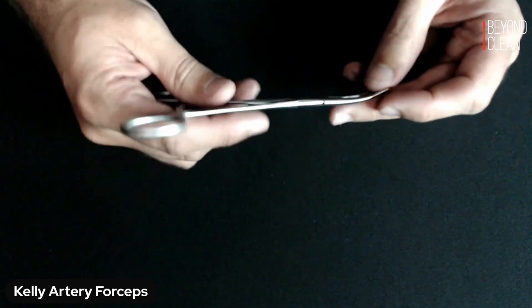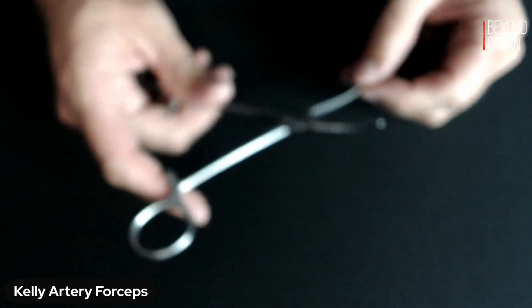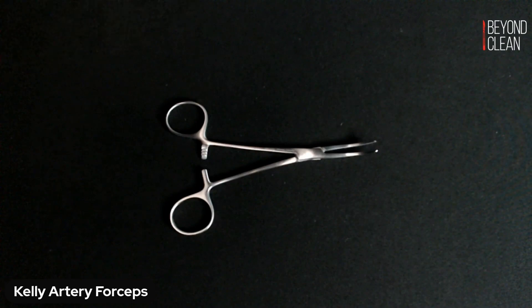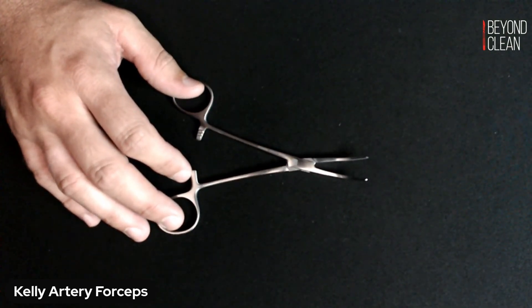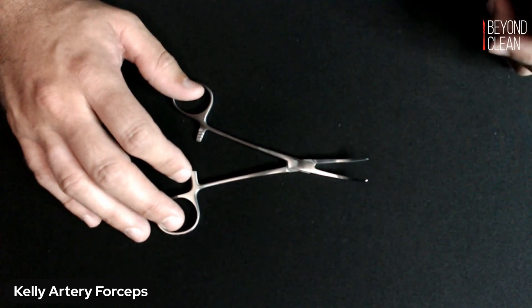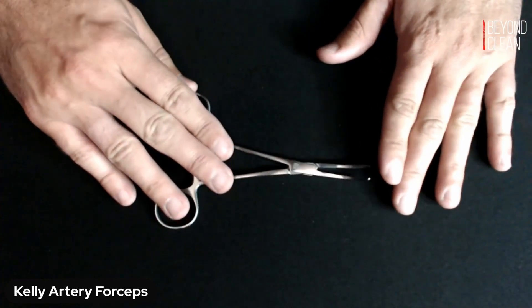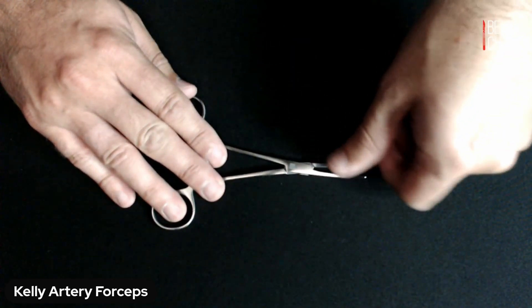You can also test the latches. If you're looking at Kelly's and Crile's, sometimes they're a little difficult to tell from one another — just like with your Mayos and your Metzenbaum scissors. The Kelly's and Crile's oftentimes will play the same roles. The Kelly's will be a little thicker, just like your Mayo scissors, and the Crile clamps — that's another style of clamp — is a little thinner. That's one tip-off to tell them apart.